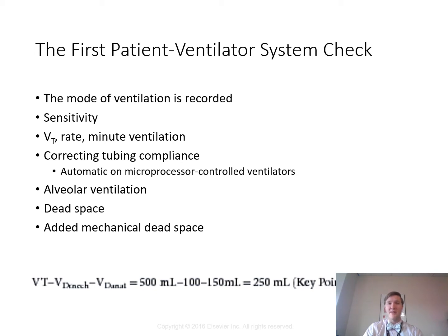Or what if we put the patient on non-invasive? What if you do bi-level positive airway pressure? Or even non-invasive ventilation, right? So those would be the modes, right? Examples of different modes that you would write there.